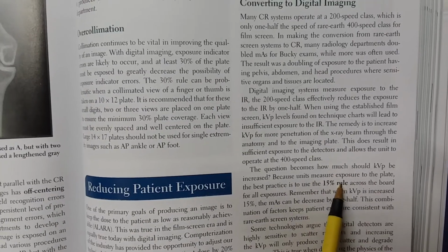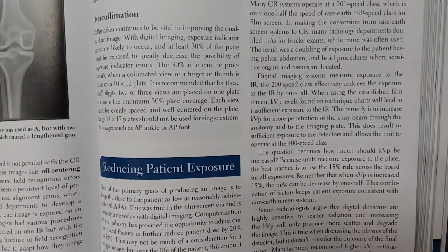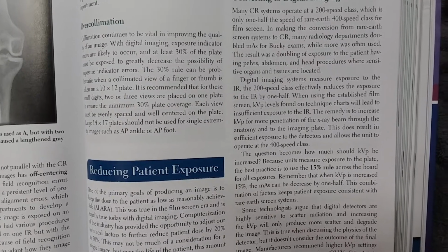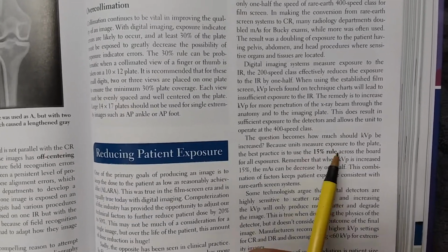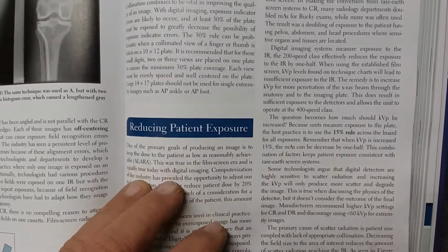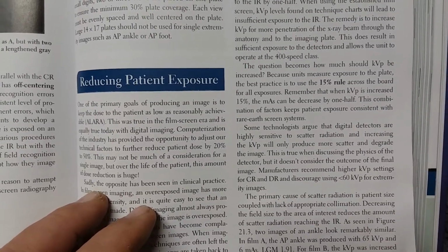A 15% increase in kV would double the exposure to the image receptor and thus allow you to use the same mAs with the computer that you did with the film screen, rather than doubling the mAs. So you can keep the mAs the same, but increase technique for kV by 15%. Look back at the 15% rule that we studied earlier last fall if you need more information about that.